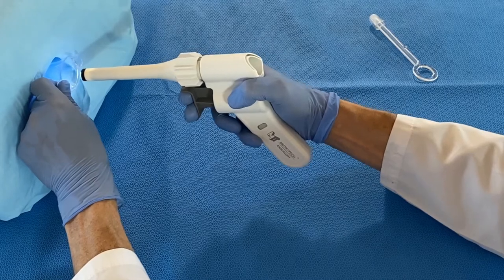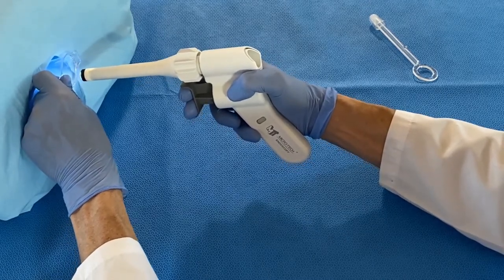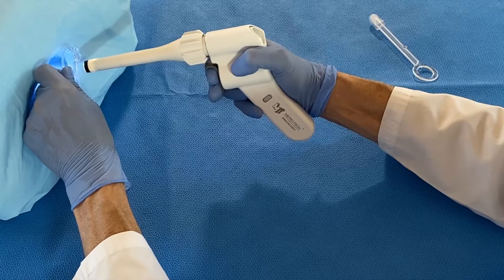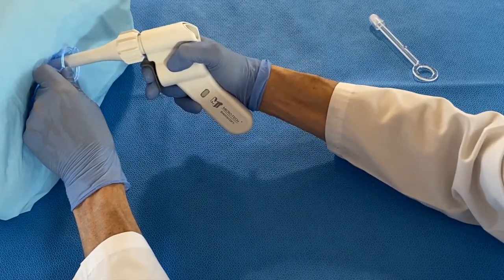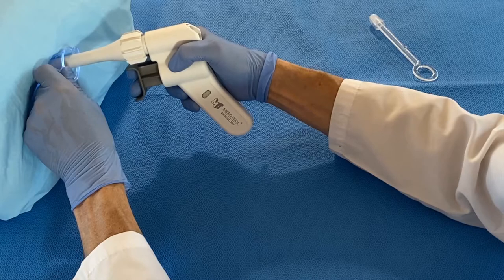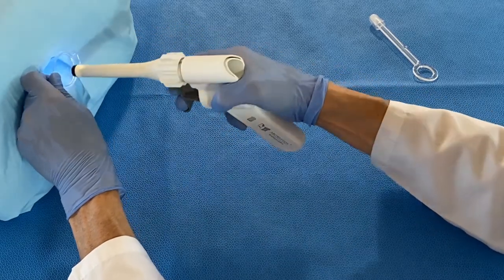Perform rectal examination and insert the anoscope. Remove the obturator and pull the anoscope back to get the hemorrhoids in view, then reinsert it back just at the upper border of the hemorrhoids and tilt the anoscope towards the target tissue. Squeeze the trigger to create suction and approximate the tip of the ligator to the target area. Release the trigger — this will suction the tissue in. Turn the outer tube 180 degrees clockwise to release a single band. Up to three ligations can be performed.